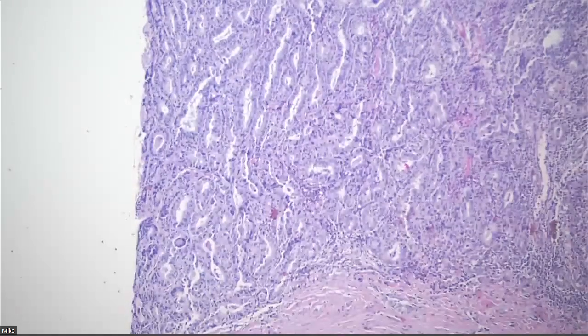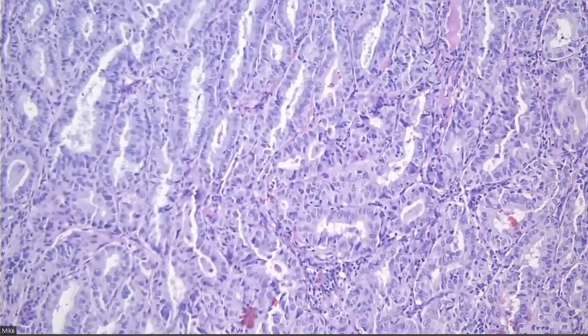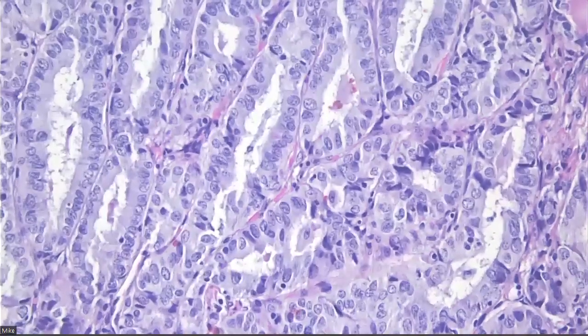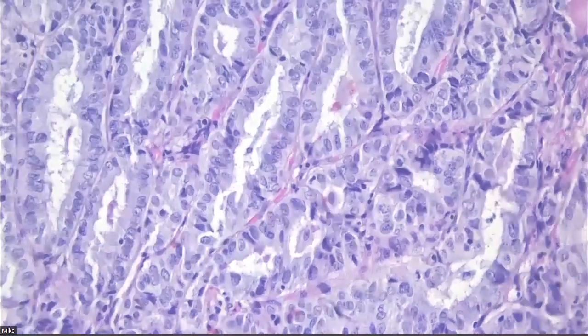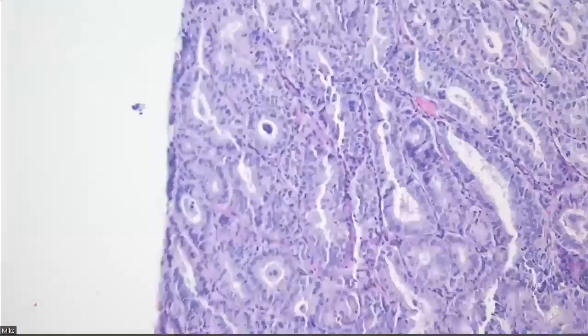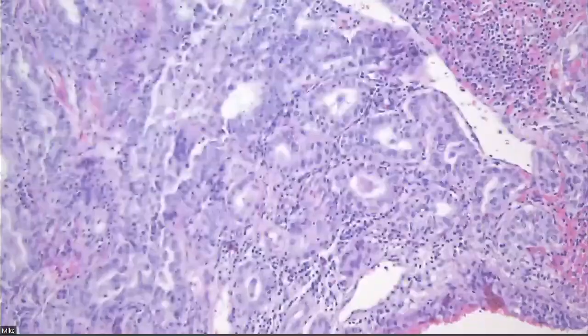So this is an example of that, right? This is a thing that's got a crap ton of necrosis here in one corner. It's got a well-developed area here that looks arguably quite good for probably a PTC, right? It's got thick cells and wrinkles and, okay, kind of complex architecture a little bit.